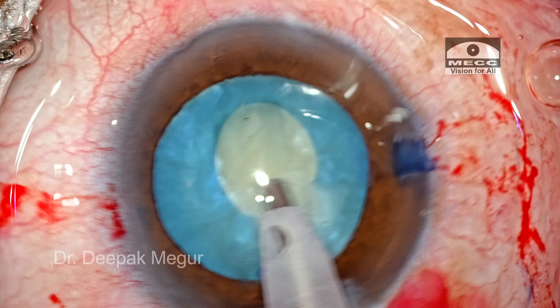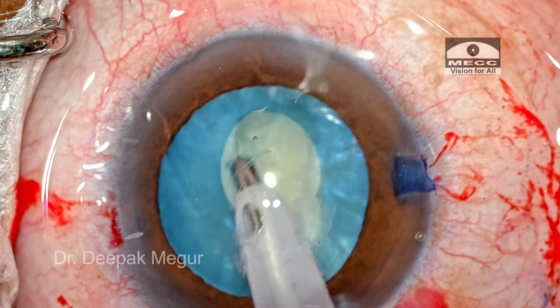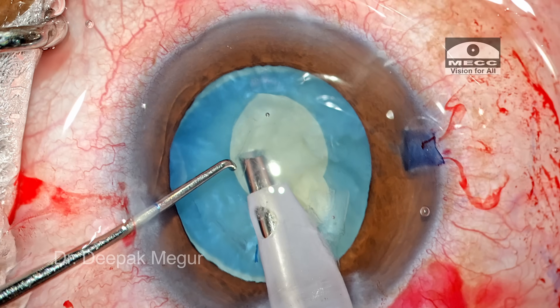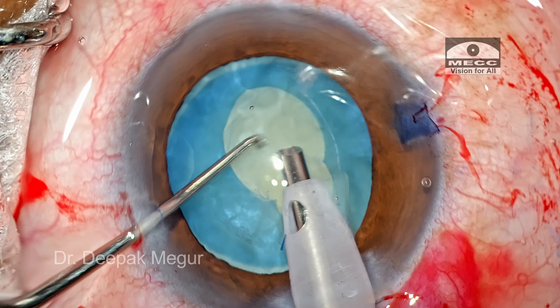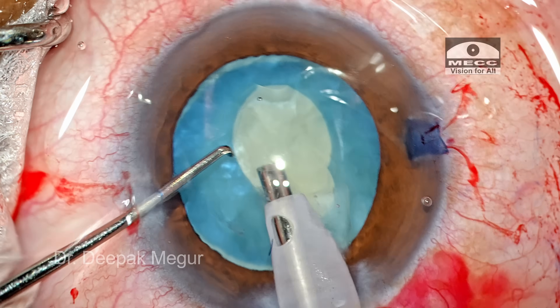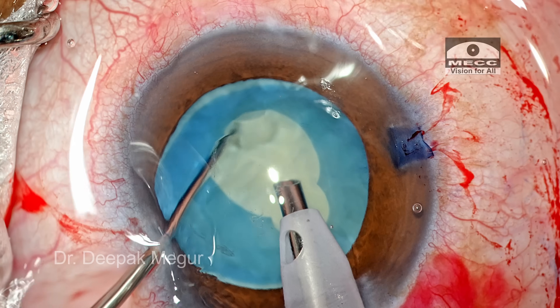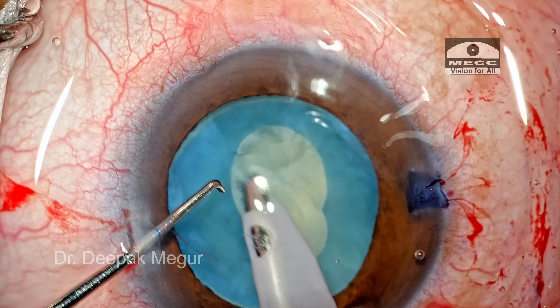The swollen lens fibers are all around in the mid-periphery and towards the equator. If I don't decompress the bag sufficiently, there is always a risk of the rhexis tear extending to the periphery during the second extension. The most critical step is to thoroughly decompress the bag by aspirating the swollen cortex and epinucleus. I'm going in with my phaco probe and a second instrument to aspirate all the overlying epinucleus and rotate the nucleus, disengaging all the cortex stuck in the equator.